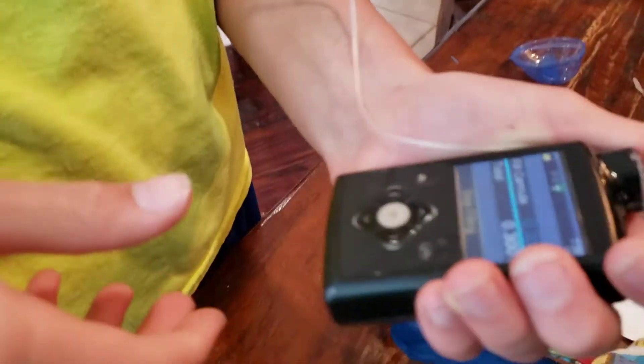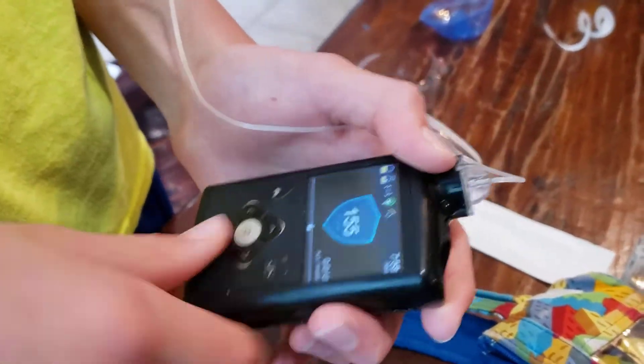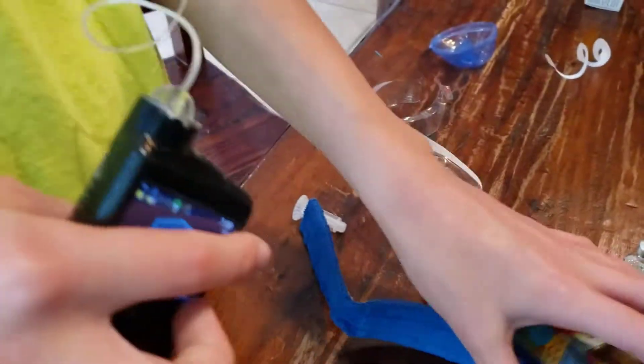Was it somewhat of a pinch the first couple times? It's still not our favorite thing to do, but hopefully this helps all the type ones out there. And then it will just go back to your home screen.